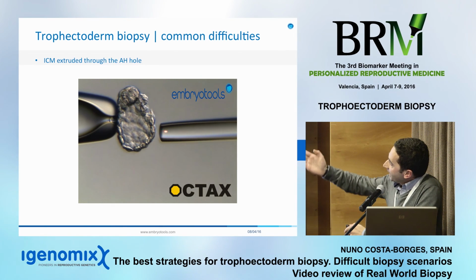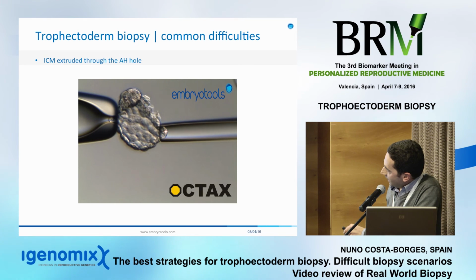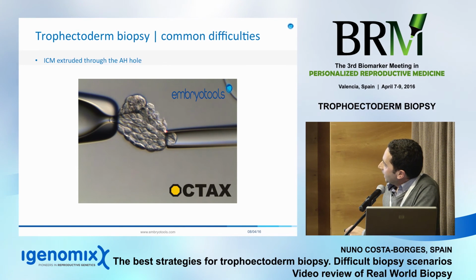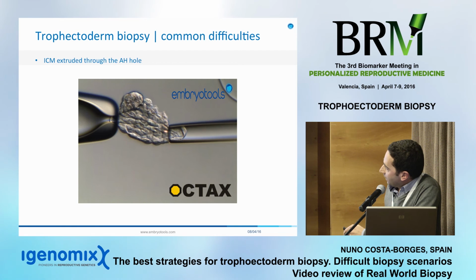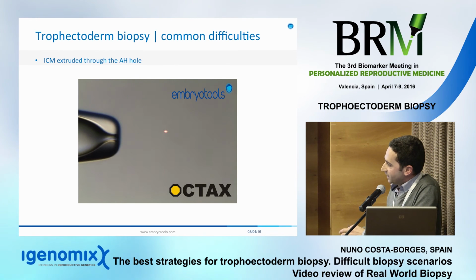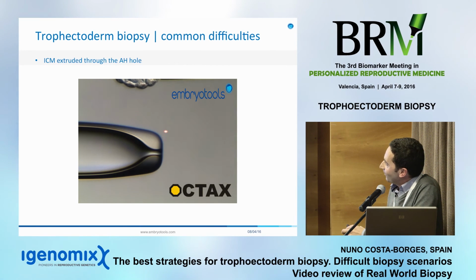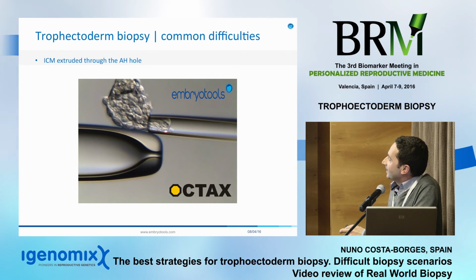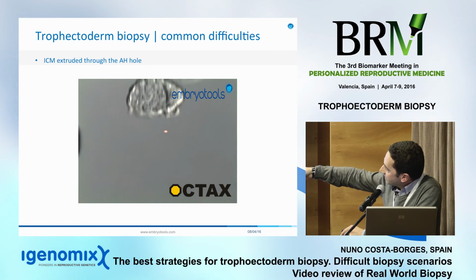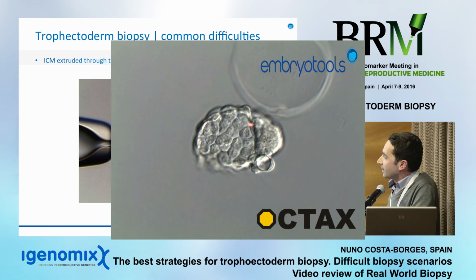And here, obviously, we're not going to hold the blastocyst through the inner cell mass. We just hold it next to it, so we avoid having suction in the inner cell mass. And then we do a few laser shots with very low intensity. We don't need to apply too much energy, although Klaus always mentioned that the intensity does not matter because we are working in infrared wavelengths that are safe. But you see here, you take the cells there. You are able to count the nuclei. So in this cluster we have 8 cells, and the blastocyst is perfect.